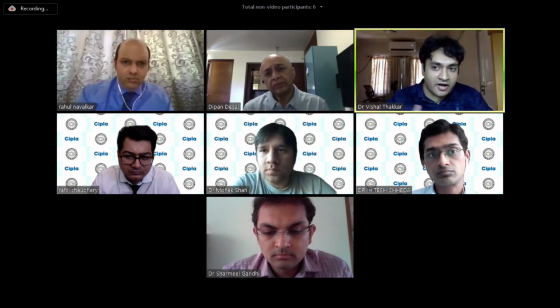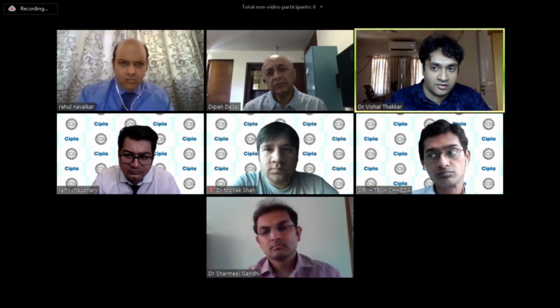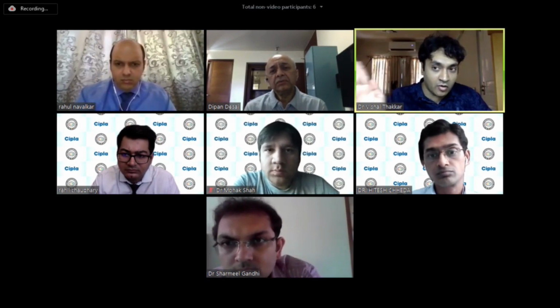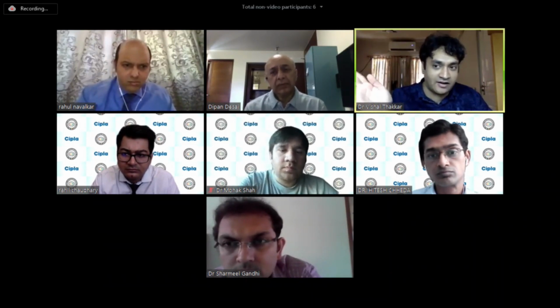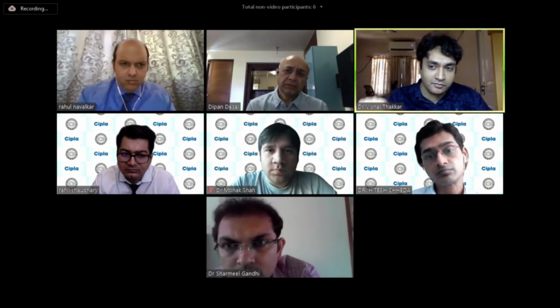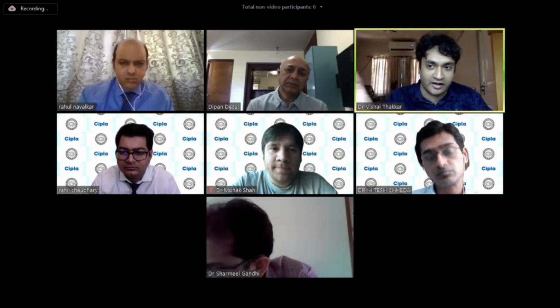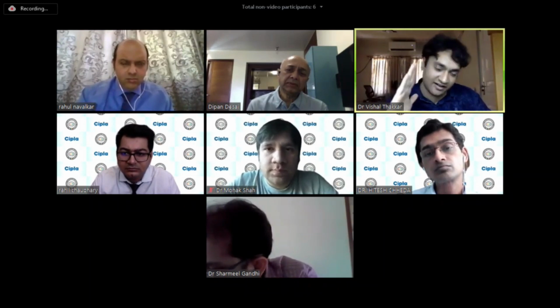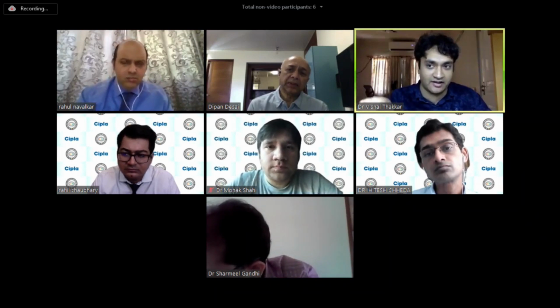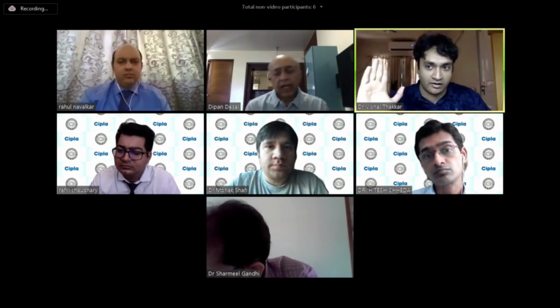Compared to the marker system, these new markerless systems like Callisto and Verion are pretty excellent, and we have got new results. There are new case studies in the Journal of Cataract and Refractive Surgery that the toric alignment is more accurate and more within the intended axis of placement with these technologies compared to what you do manually. With manual markings, you are likely to get somewhat inaccurate results, because even if the patient slightly tilts their head, you are bound to get a false result. But with the Verion or Callisto system, it is fingerprinting your limbal vessels. So no matter how your patient rotates their head, you are likely to have a very accurate result.